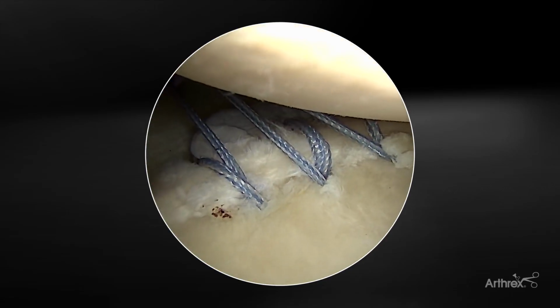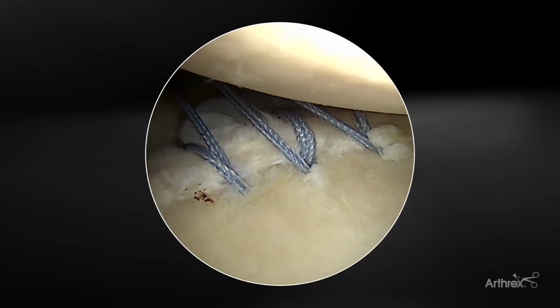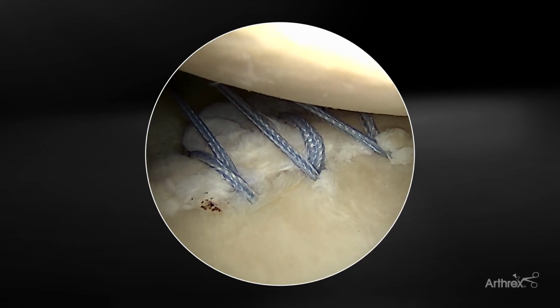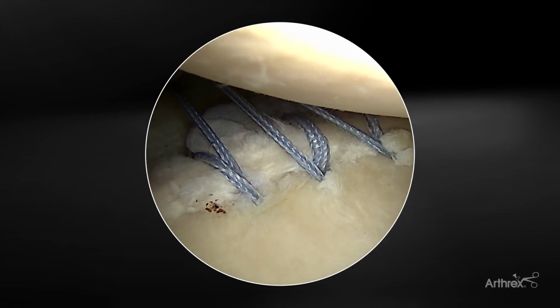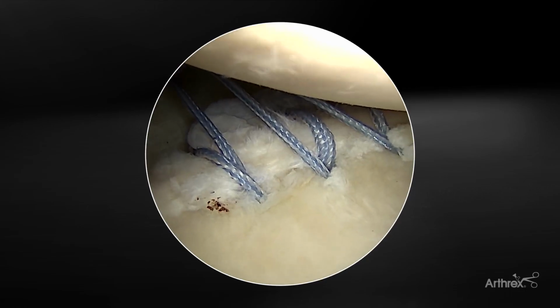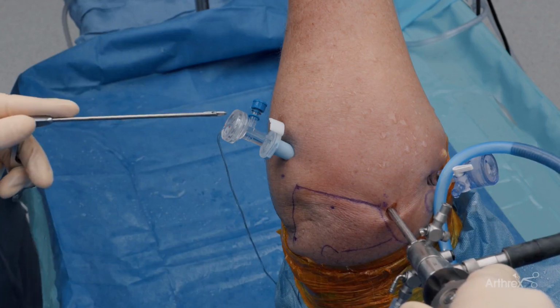So we have 3 anchors placed now. One of the big advantages of this anchor, and why I really love using this anchor for my instability repairs, is whether you're trying to do a capsular shift, or you're trying to do a capsular labral advancement, or even just a simple labral repair, being able to wait until the end to tension all of these is a huge advantage over some of our standard anchors. And so we're going to demonstrate that now.